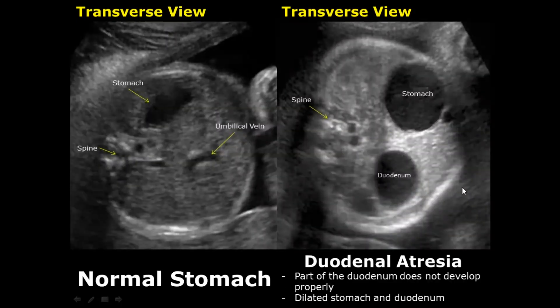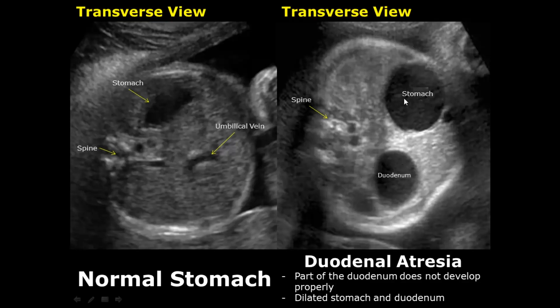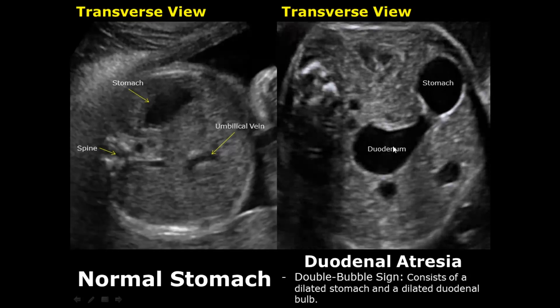A normal fluid-filled duodenum cannot be seen on ultrasound; it is only visible when dilated. In duodenal atresia, part of the duodenum does not develop properly, leading to dilation of both the duodenum and the stomach. Here we see two dilated structures — one is the stomach and the other is the duodenum. The double bubble sign is the name given to this appearance, where the stomach and the duodenum both appear as two dilated anechoic structures. This is a sign of duodenal atresia.